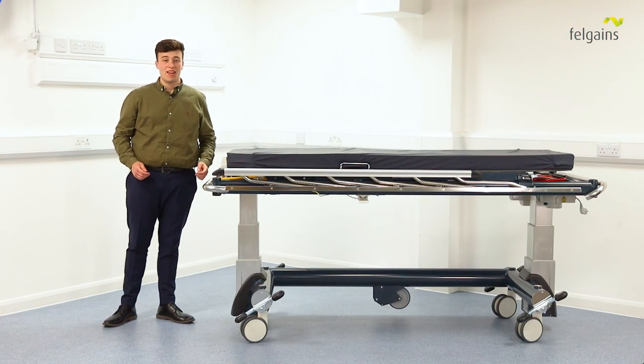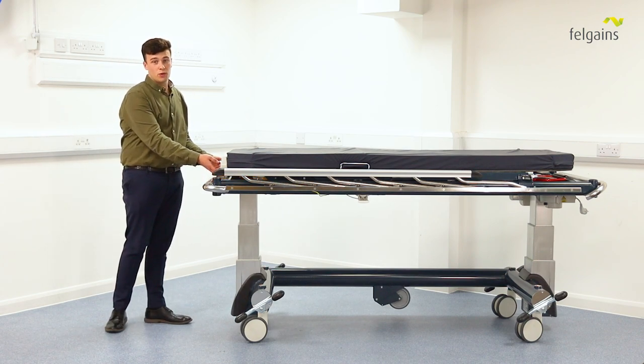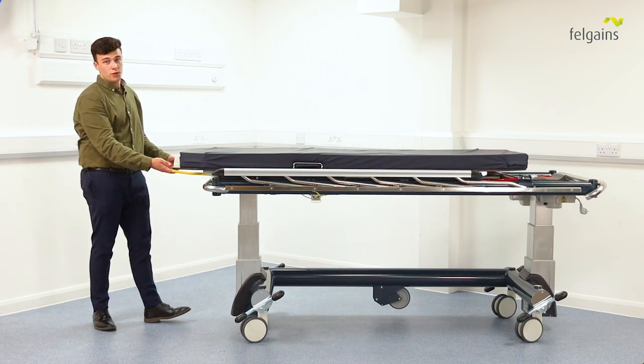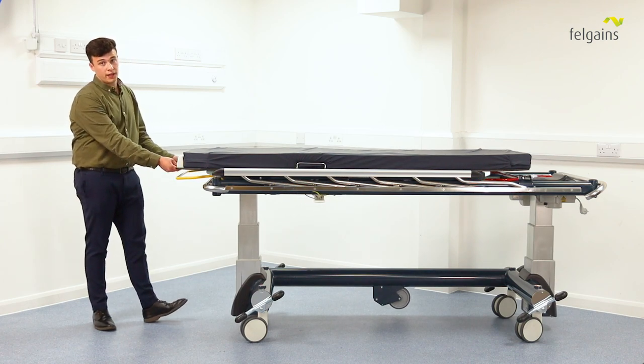The ImageFlow has a market-leading 490 millimeters of longitudinal slide on the mattress platform. I'll now hand over to Ernie to tell you more. So how does it work? To slide the mattress platform, simply lift the yellow handle, pull the platform towards you or away from you, drop the handle and it will be locked back in position.